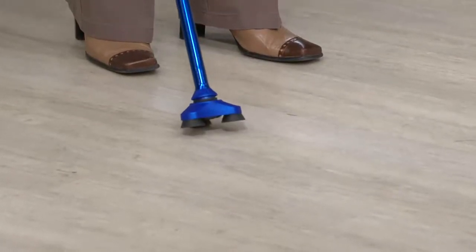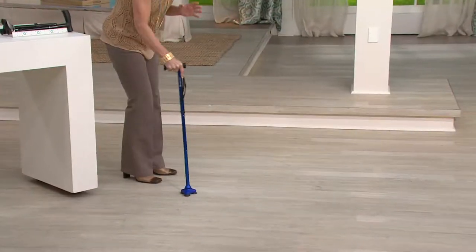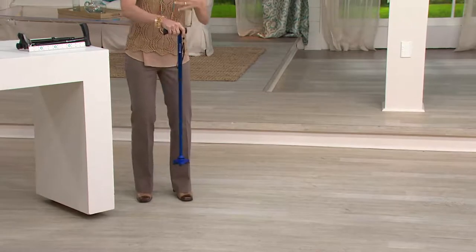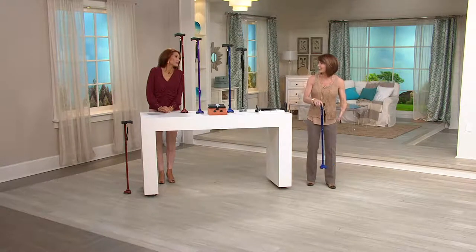You can see how it rolls back and forth like the foot would, and also 360 degrees around. What that means when you're using it is it takes the impact — or the contact — out of your wrist, out of your elbow, out of your shoulder. So now the cane's working for you, not against you.